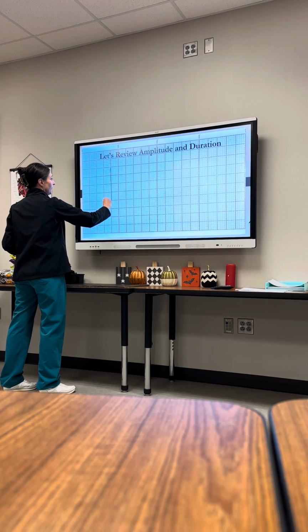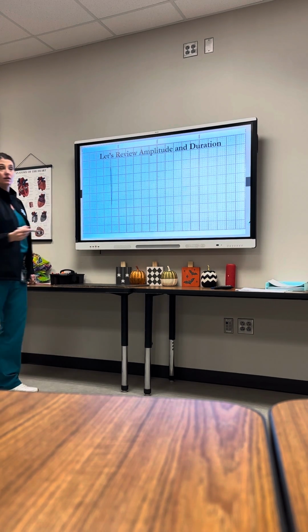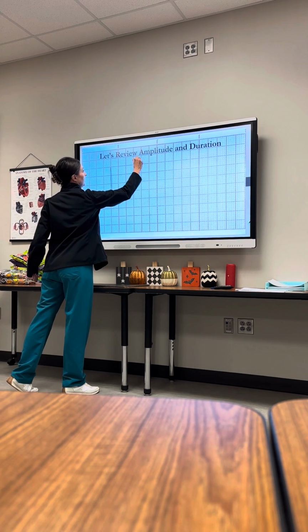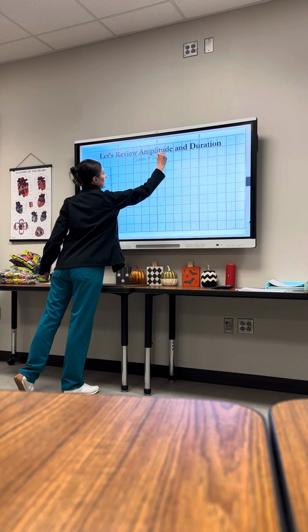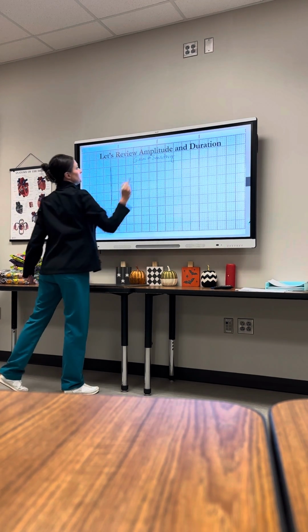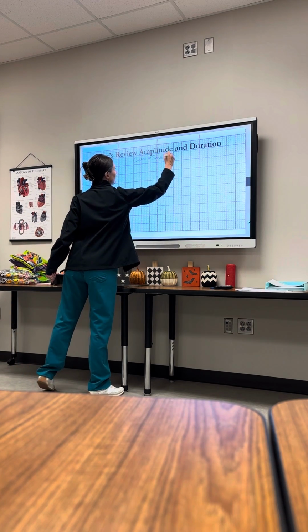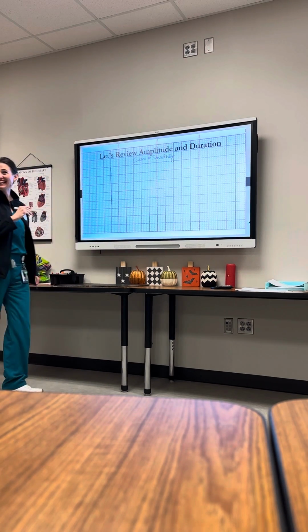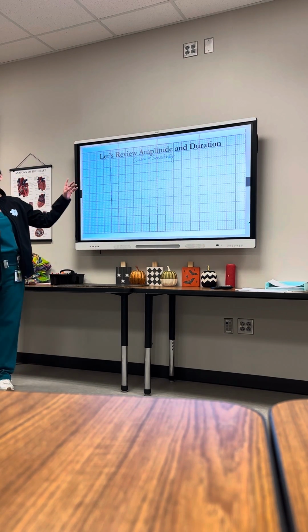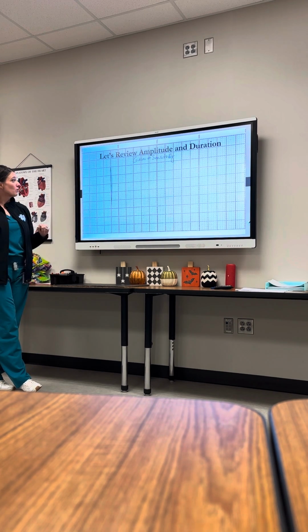What are some other words for amplitude? Sensitivity. All the same thing there. So we're talking vertical axis or our y-axis.